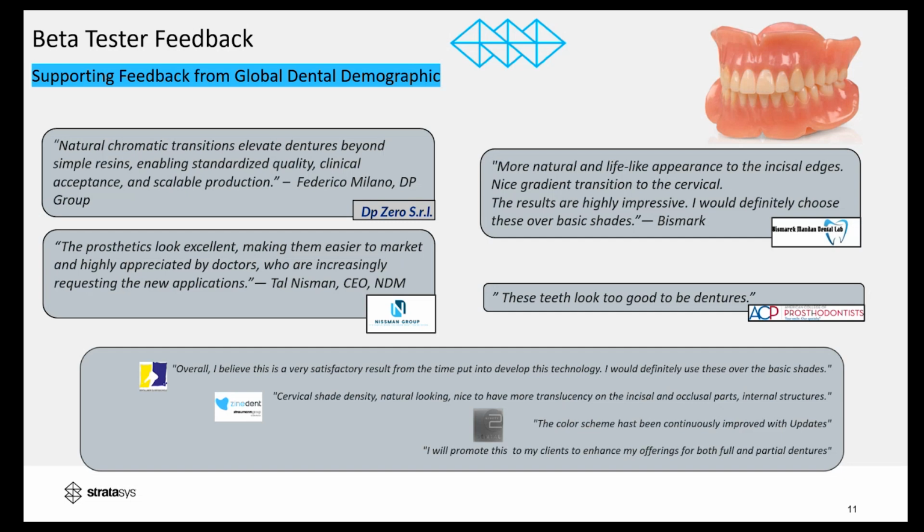We have this software update. These features have already been tested for the past few months with a list of different labs throughout the world, in the United States, in Europe, and we try to get as much feedback as we can before getting it out to all of you, because we want to have the best product out there when you get it. This is some feedback we got from different labs that tried it. So far, the comments and feedback are amazing, and it's very great for us to receive such nice feedback.